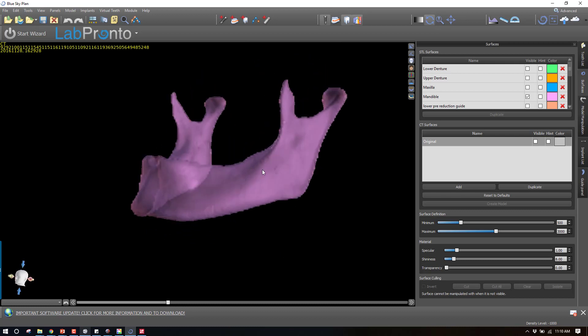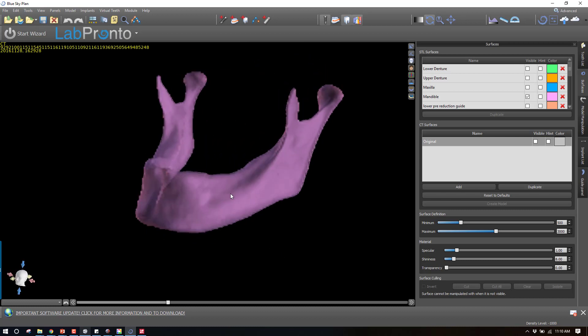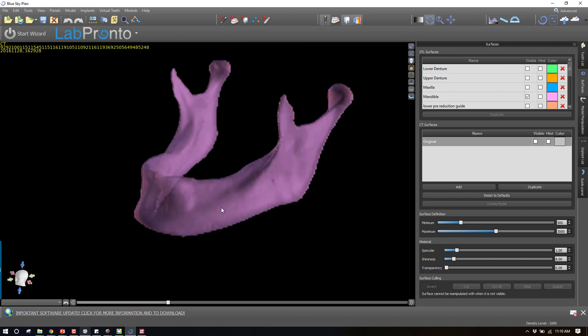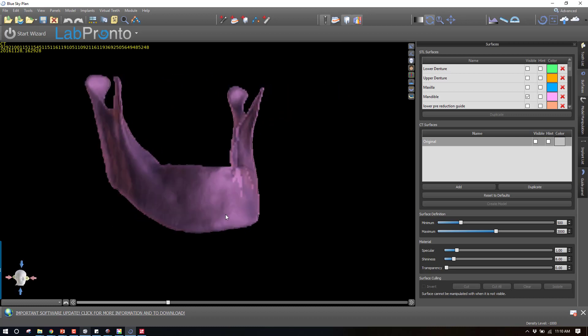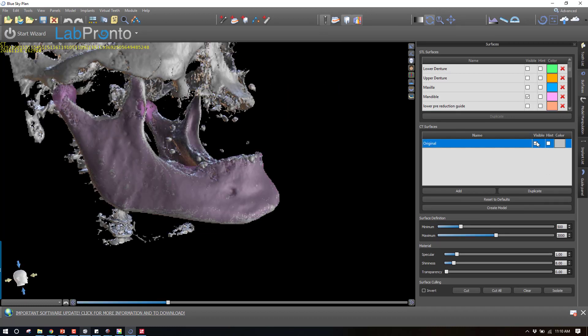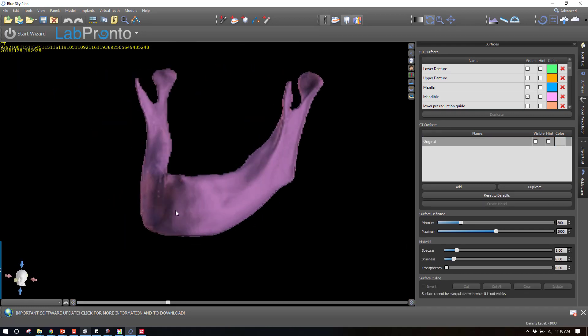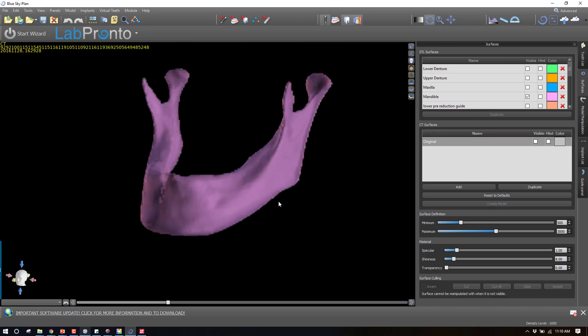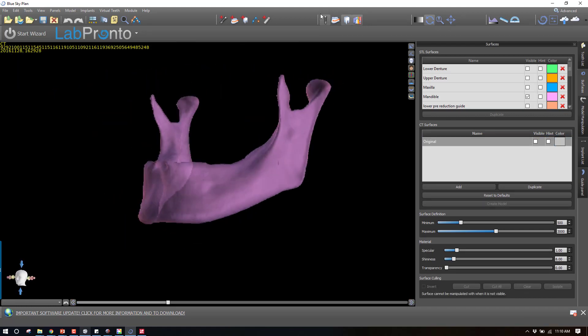The first thing you need to do is start with a segmented jaw. In this case, we've got the mandible segmented. If you turn the CT on, you can see that coincides exactly. This was done by Image 3D Conversion. They do a really excellent job at that.